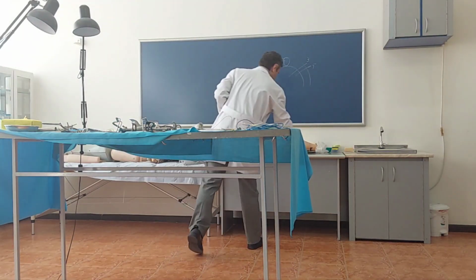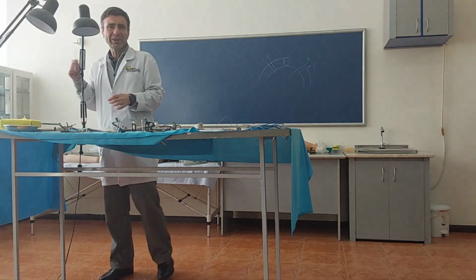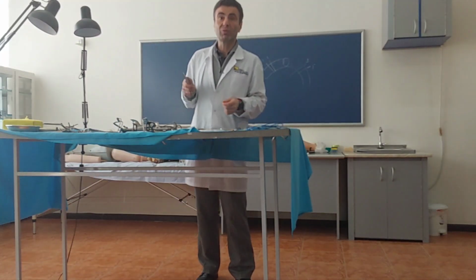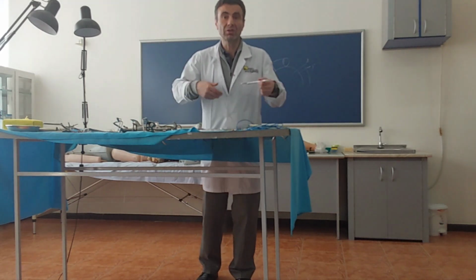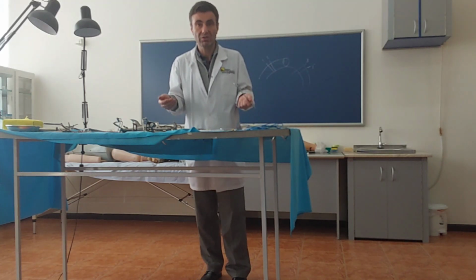Let's come to the 5th group. In the 5th group of surgical instruments, all instruments can be divided into 2 subgroups. First one we call instruments for hand suturings. Second one we call instruments for mechanical or automatical suturings. Other way we call them staplers.